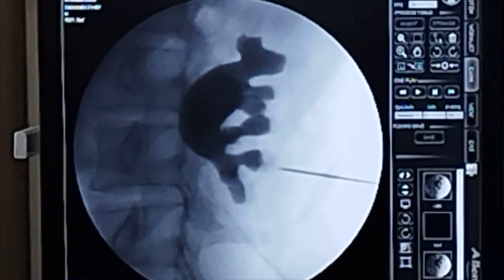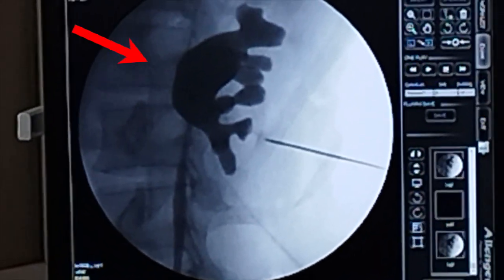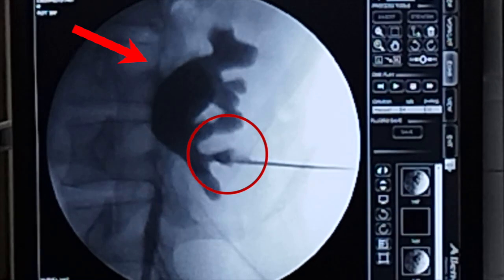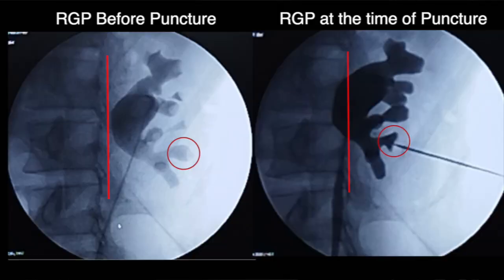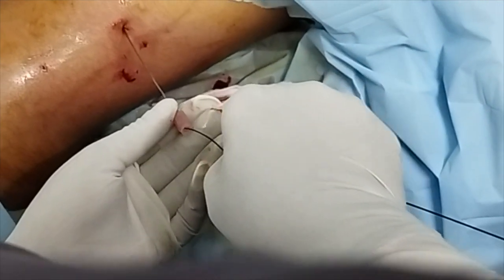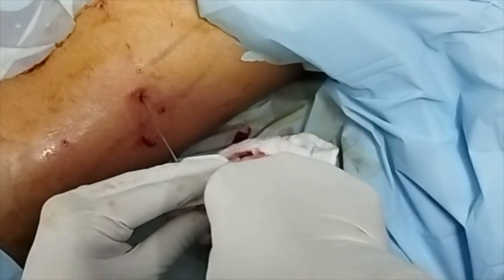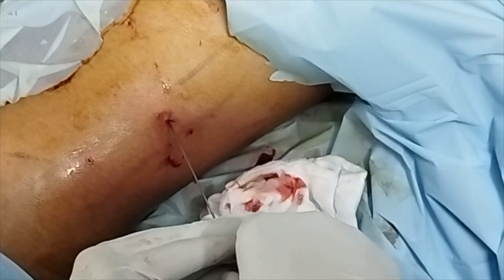Now, after readjusting 10 mm anterior, see the cupping — see the kidney movement to the opposite side. This is a very important sign. I am withdrawing; better not to cross the infundibular line. After withdrawal, the cupping was very obvious and the kidney moves up towards the spine, towards the middle of the spine. These two movements make the puncture very clear. You can see the small marks where I had punctured posteriorly.